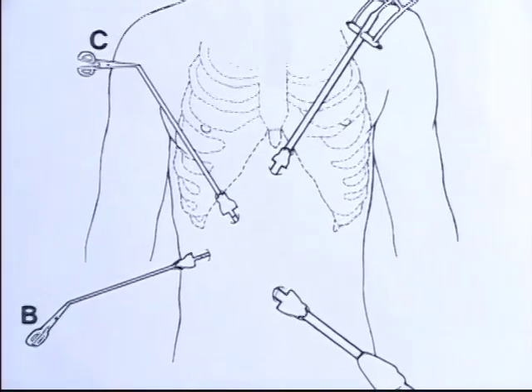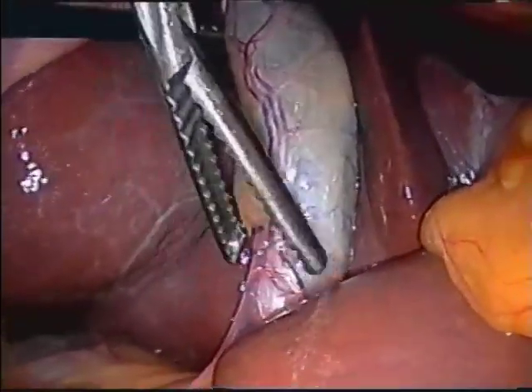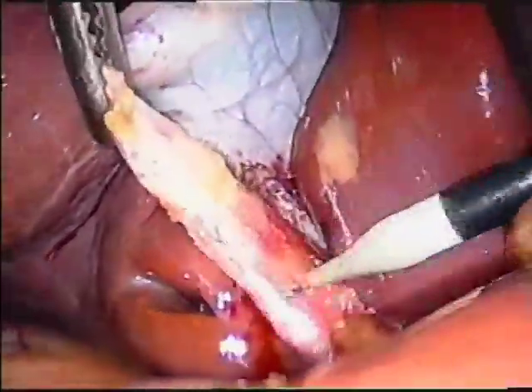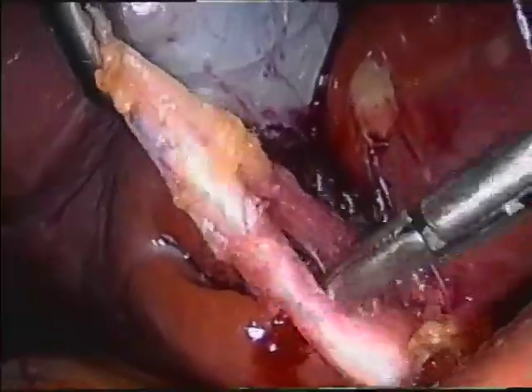The Kumar clamp is applied through the right mid-subcostal port at the beginning of the laparoscopic cholecystectomy procedure. It is used as a grasper for traction at the infundibulum during dissection of the cystic duct and artery. The valve at the upper end of the clamp channel is closed during this stage of the operation to prevent loss of pneumoperitoneum.